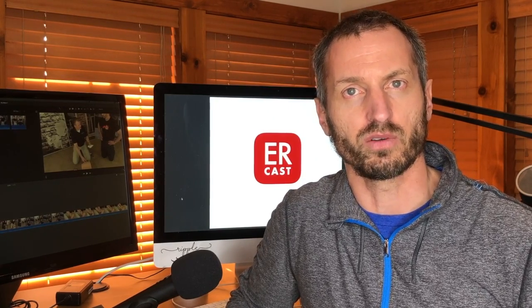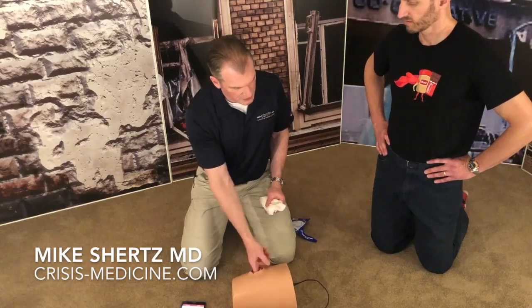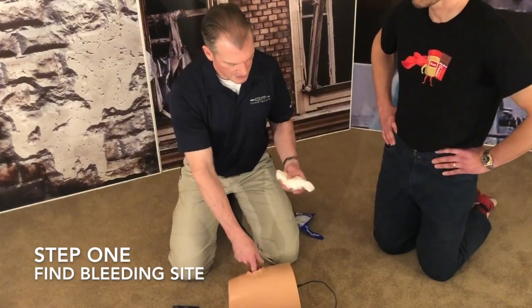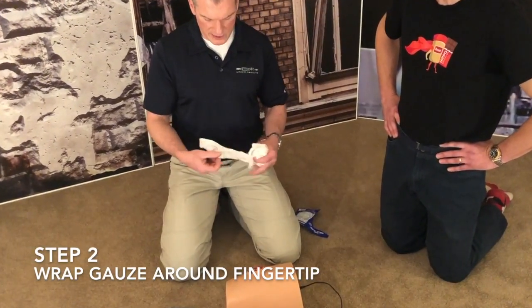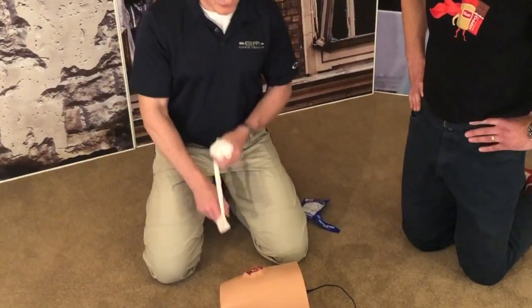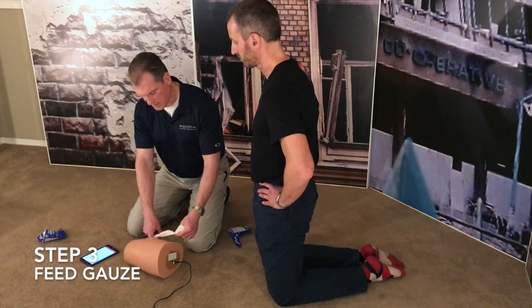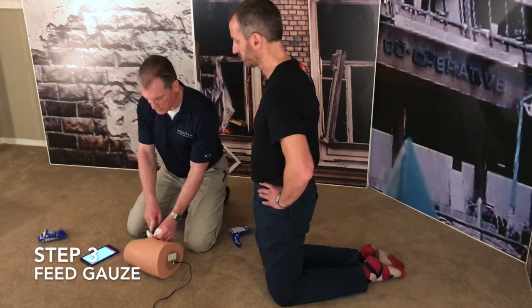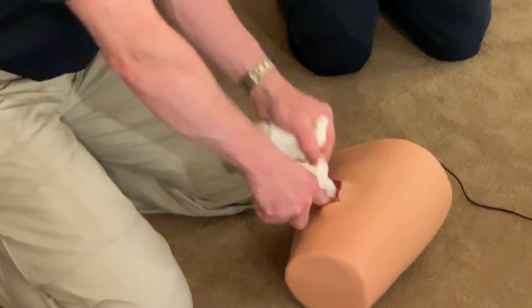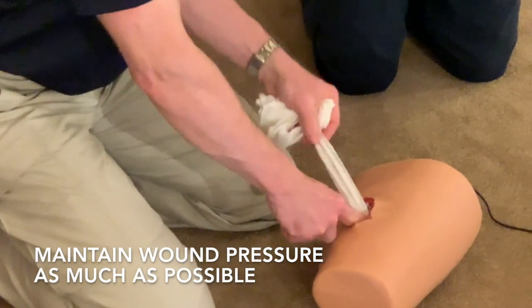How to pack a gunshot wound. Step one: stick your finger in there and figure out where it's bleeding from, because if not, you don't really know if you're packing some blind channel. Step two: take the end of the gauze — this is training combat gauze — wrap it over your finger and then put the first wad there. Then extend out about six to eight inches and feed it to yourself. As soon as your finger comes out, you push that in, then feed a similar length and push it in. So you're almost always in the wound, and that keeps pressure on the wound a lot faster.